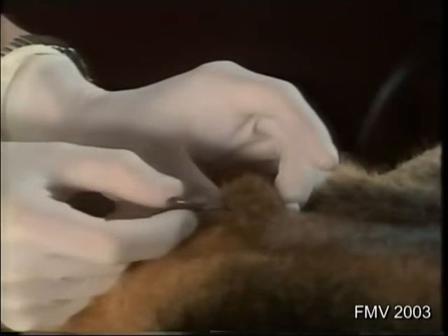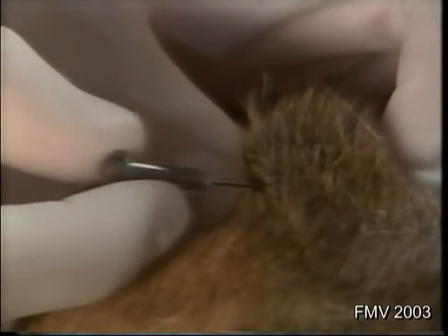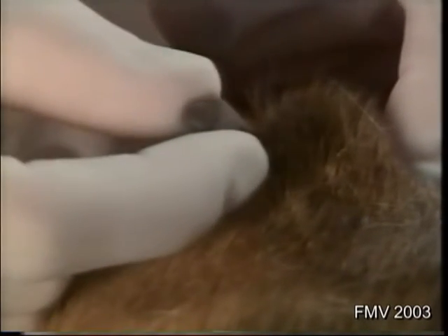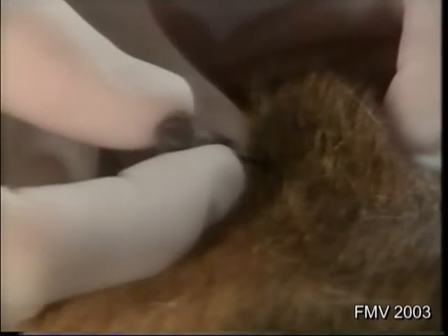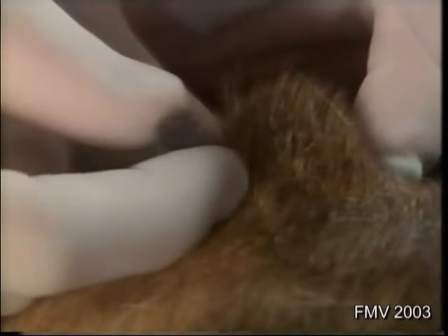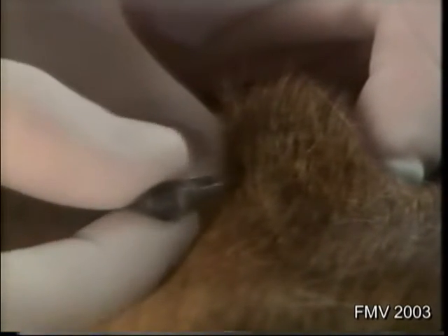If blood enters the needle, stop sampling, remove the needle, and spread your specimen on a glass slide before clotting occurs. If blood contamination of the specimen is significant, the sample quality may be poor, and the procedure should be repeated until a sample that has little or no blood contamination is obtained.